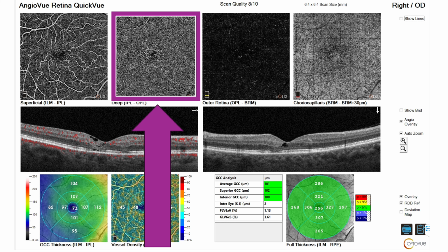It's a great point because understanding which slab to look at is going to help to identify the pathology. It's almost like when you think about retinal angiomatous proliferation, which is a type 3 choroidal neovascular membrane. People don't recognize that this is actually a disease that originates in the deep plexus. It's not like a normal CNV. So on OCTA, looking specifically at that deep plexus is going to really help you to understand the pathophysiology. So yes, that's a great point, Melaine.